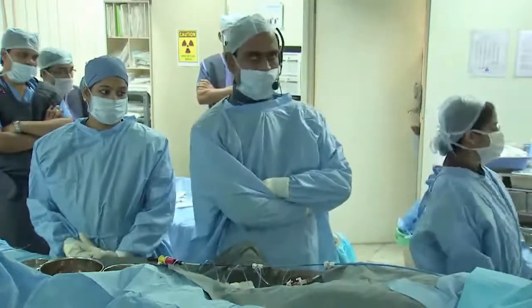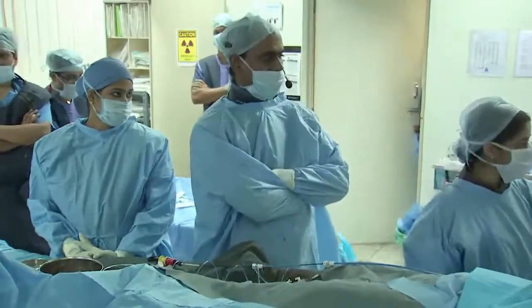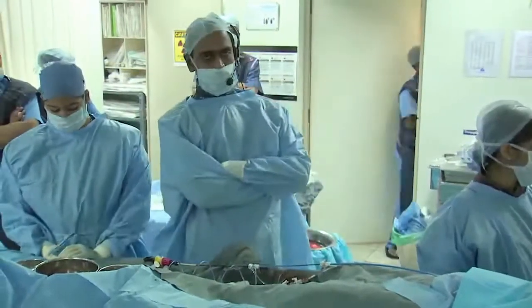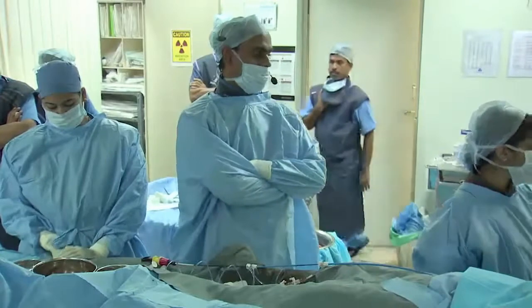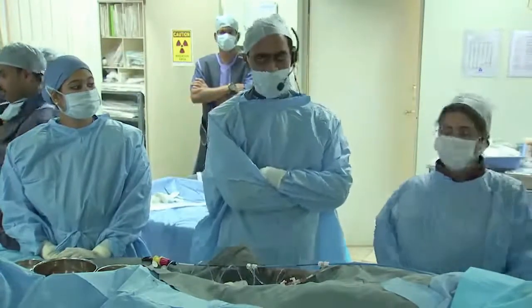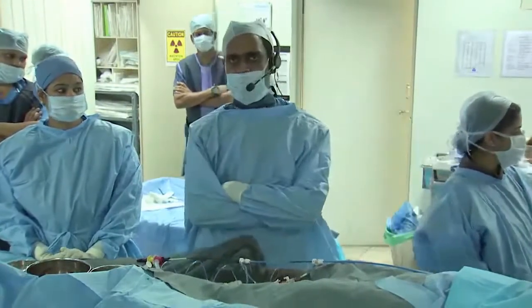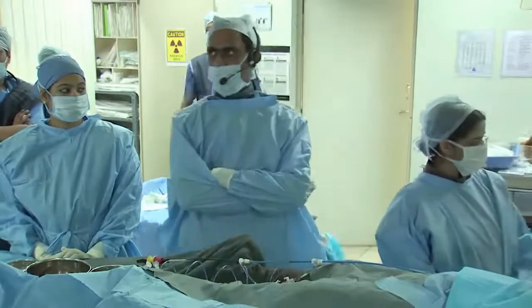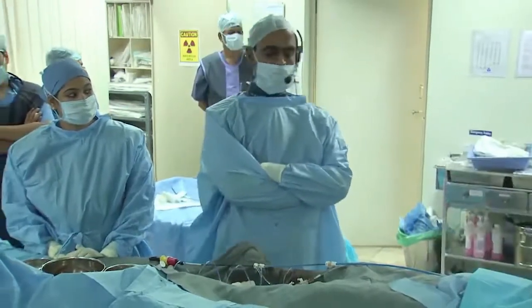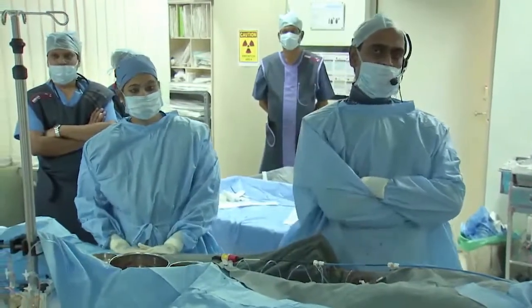we wanted to have some fair amount of increase in the oxygen saturation. Right now, as I speak to you, the child is not on any supplemental oxygen. The saturations are 83%. It has marginally increased by about 5% compared to the pre-procedural, like at the beginning of the procedure. The Fontan pressures are not substantially elevated. It continues to remain at the same 13.